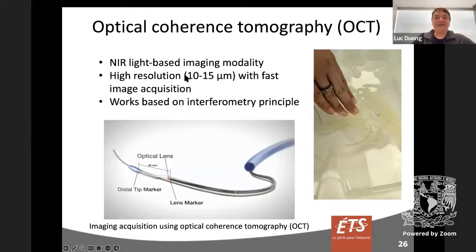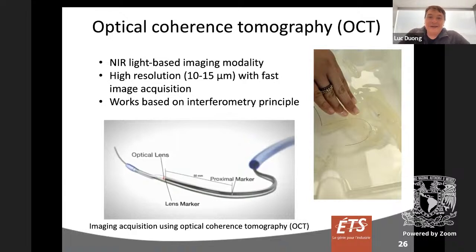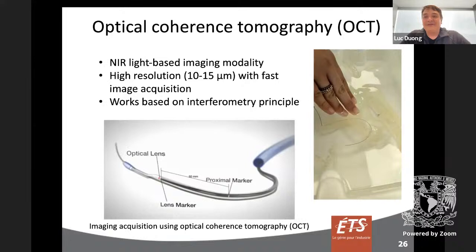This is one work we did using optical coherence tomography. Okay, what is OCT or optical coherence tomography? First of all, it's very important not to confuse it with CT. OCT doesn't have to do with radiation at all. It's completely different. It's purely a light-based modality. I will show you how it works.